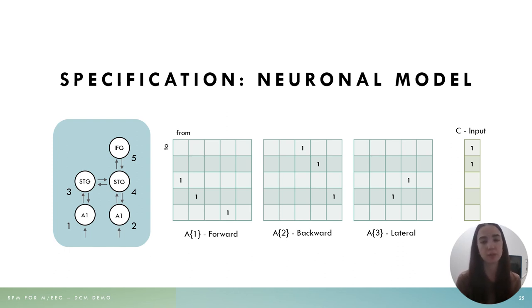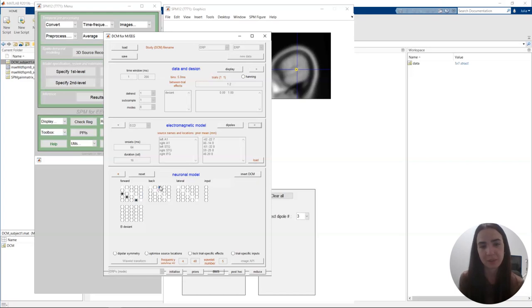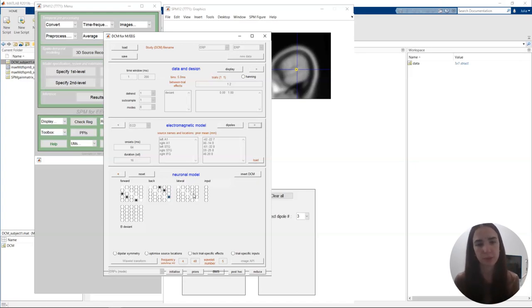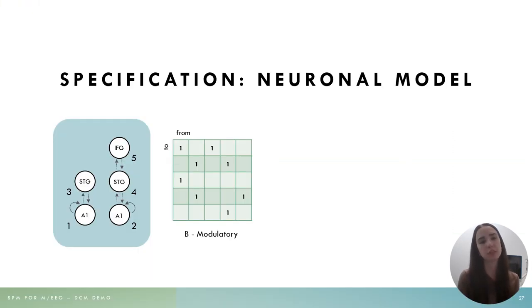The C matrix (or vector) represents our inputs. Here we have inputs coming into left and right A1 — sources one and two — so we'll just have a 1 in the first two rows. In the GUI, we just click on the relevant connections, going every time from column to row, specifying our lateral connections from three to four and four to three, and then our input. Once we have specified our A matrix, we move on to the B matrix.